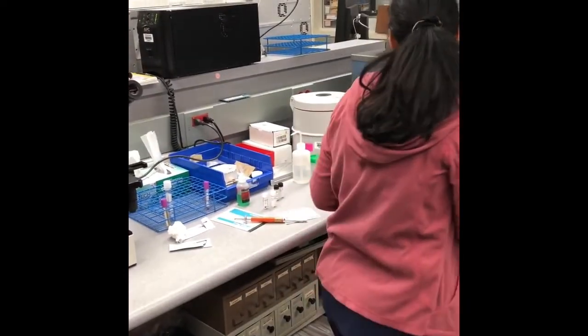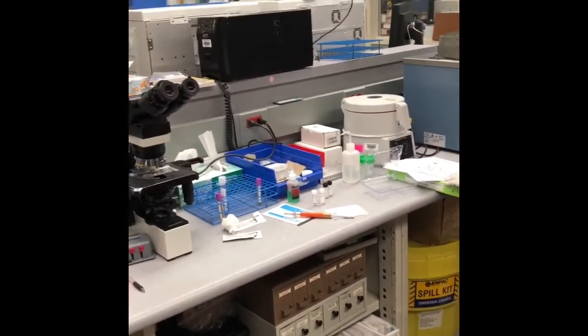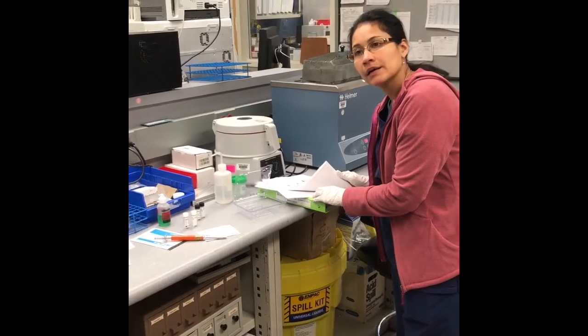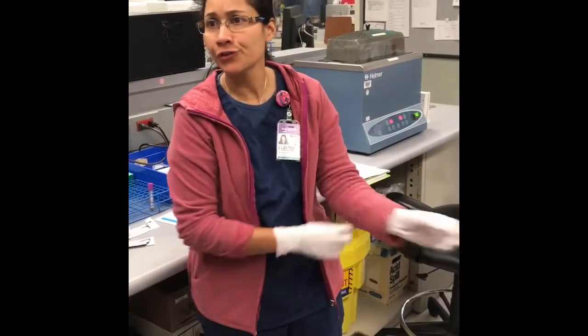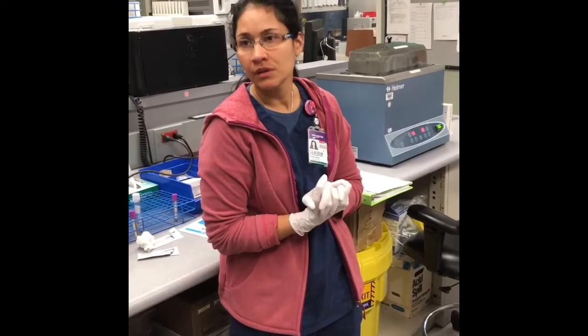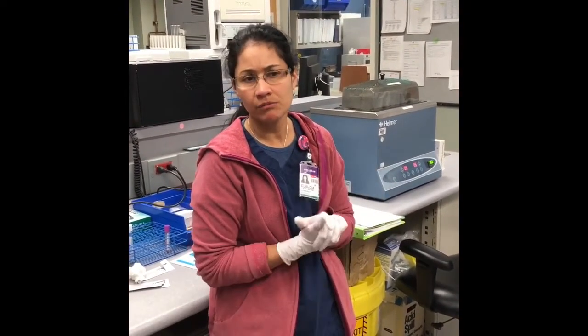WBCs. Did you have to make a comment, like no WBC seen, or you just hide? That's all. You don't have to make any comment, no report. And the reference will be right there for the doctor to see that 0 to 5 would be considered normal. Pretty much you will see just lymphocytes right away.